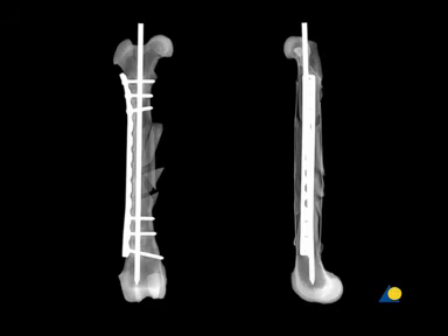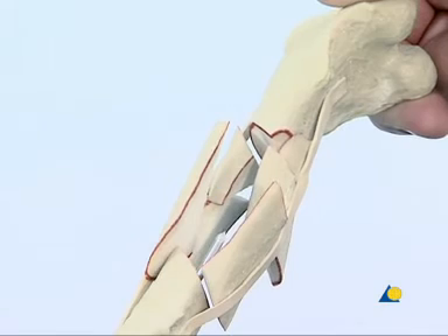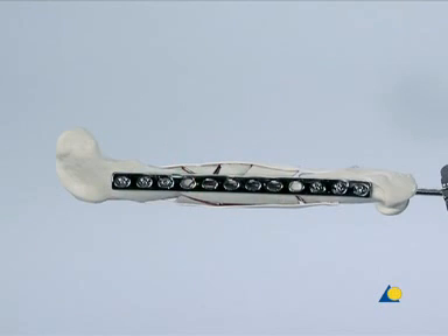The postoperative radiographs of the bone model show the restored length and spatial alignment. The position of the intramedullary pin and the bicortical screws is clearly visible. In the clinic, the excess intramedullary pin is cut off. The intramedullary pin and plate combination shown in this presentation is particularly effective for bridging large comminuted fractures because of the synergistic mechanical properties. The intramedullary pin is used for fracture reduction and to restore normal length and axial alignment of the bone. This technique is especially recommended for indirect fracture reduction and an open-but-do-not-touch approach in comminuted fracture repair.